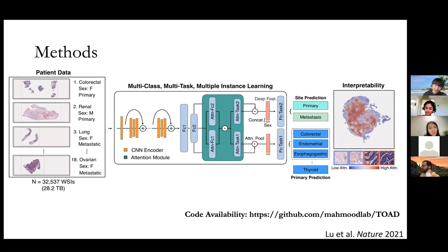But first of all, there are multiple primary tumors from different primaries that morphologically will look similar. And also, a lot of times, the trickiest thing is that your tumor is poorly differentiated or something, in which case it's not really clear at all what primary it resembles. So typically, in the clinic, for metastatic tumors, you would order additional IHC stains, based on what people have found over the years, that this stain is diagnostic of this particular tumor.